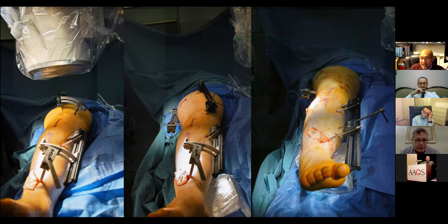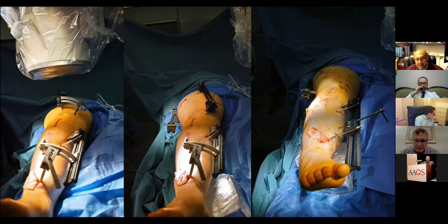And you can see here on the left image, we have a derotation construct set up on the femur. The rail is applied anteriorly in the sagittal plane because in the anterior application, the femur is straight. If you apply the derotation from the lateral side, the femur is curved and it's much more difficult to get the derotation done with a rail with the fixator on the lateral side and with the fixator anteriorly. So here we have the derotation set up anteriorly on the femur and medially on the tibia.